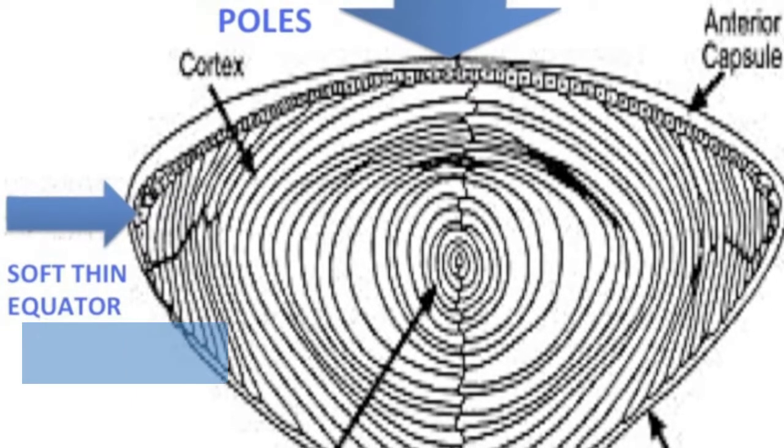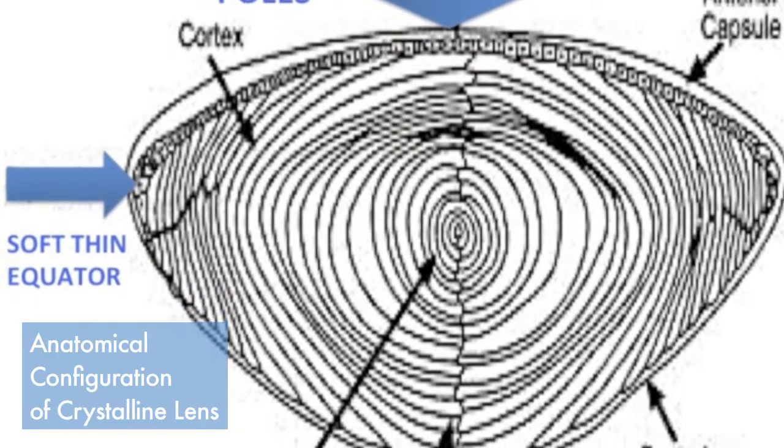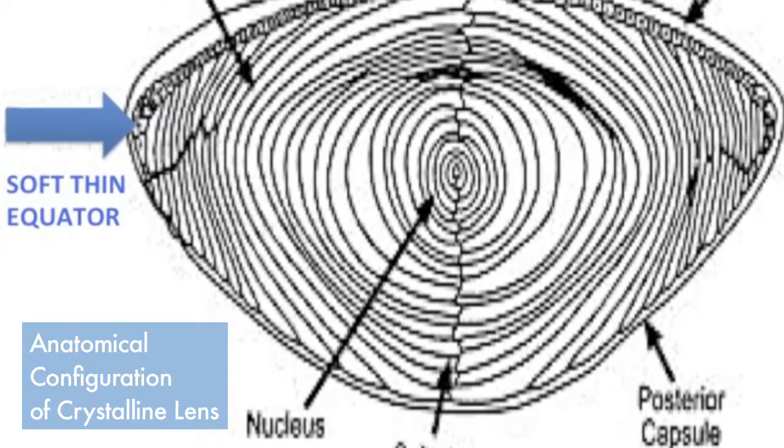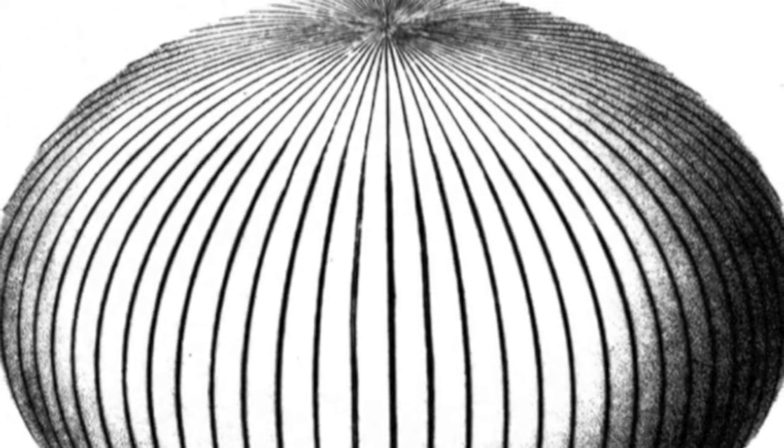Terminal chop takes advantage of the anatomical configuration of the crystalline lens, which is quite soft and narrow at the equator. This is due to the unique arrangement of lens fibers, which extend from the posterior to the anterior poles while crossing a plane passing through the equator.